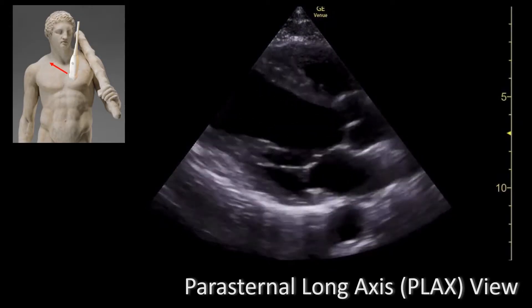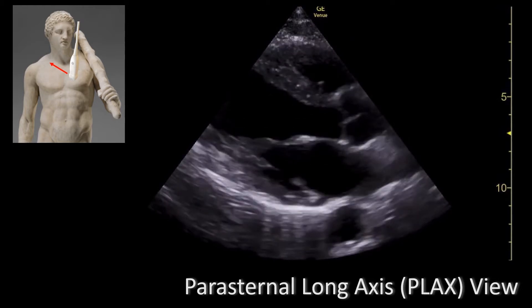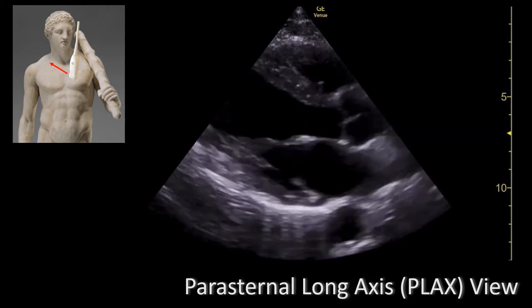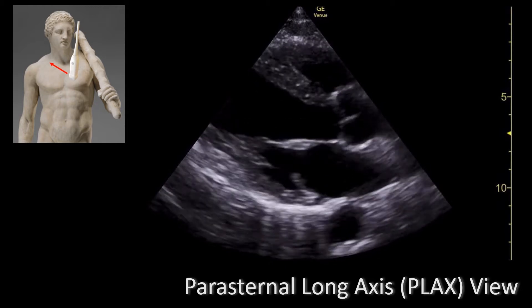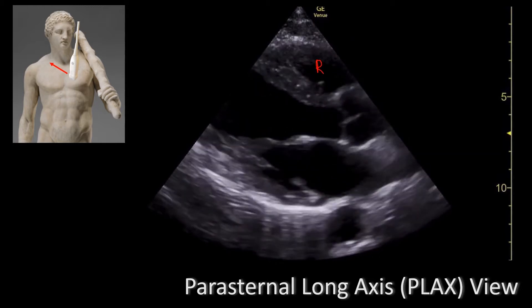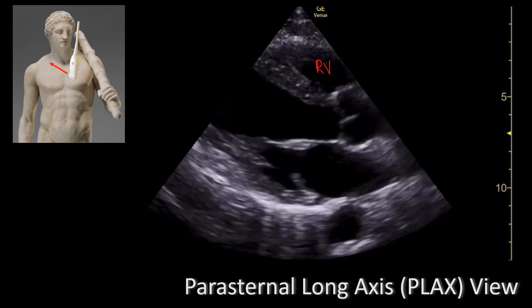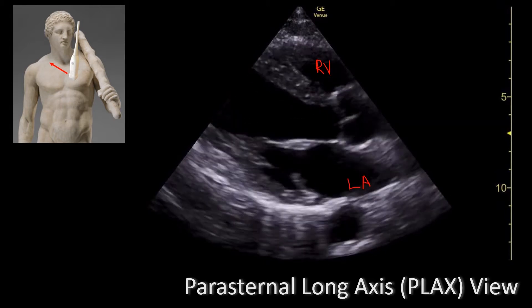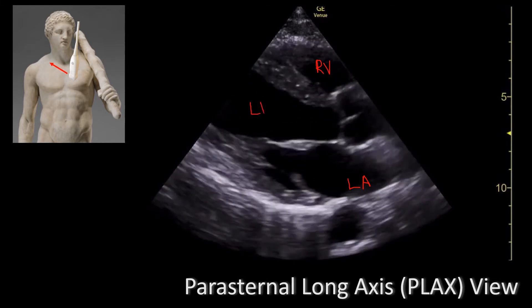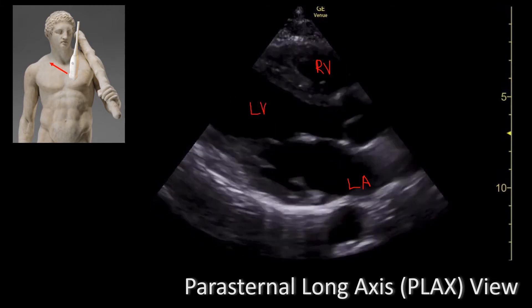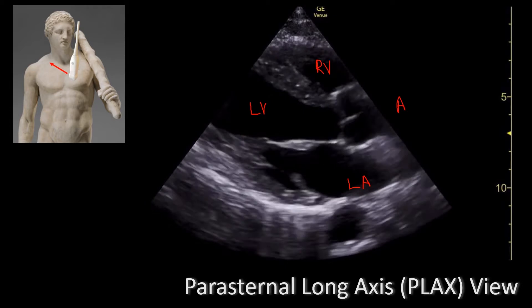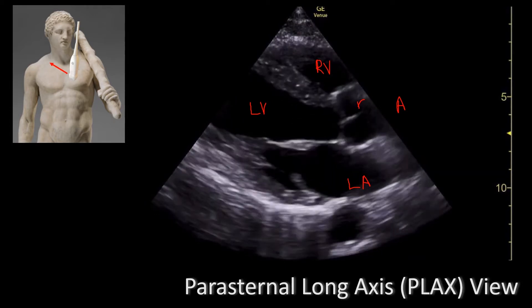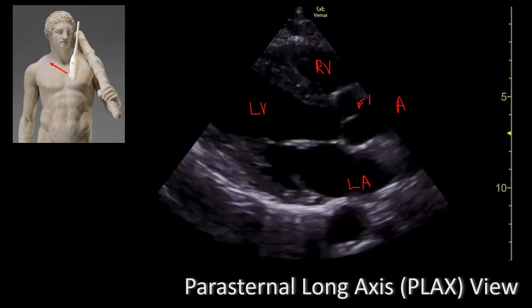In the parasternal long axis view, after you optimize your image, you should be looking at something like this. The first moving structure closer to your probe will be the right ventricle. On the other side, you have the left atrium, which empties into the left ventricle. The left ventricle will eject blood into the aorta. The structure that opens on systole is the aortic valve.